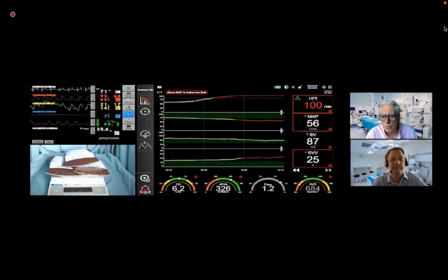So your EA dyn, DP/DT, not a lot happening there, which I think I understand now that's what you'd expect, Simon, isn't it? Because you're maintaining a reasonable degree of filling of the heart with the stroke volume, etc. Afterload has adjusted, so SVR's dropped in order to try and maintain organ perfusion. Yeah, so again, one of the things that we're commonly told is that as we hemorrhage, SVR goes up to maintain our blood pressure, but actually that's not physiological. SVR often decreases to maintain that forward flow, so we perfuse our organs.